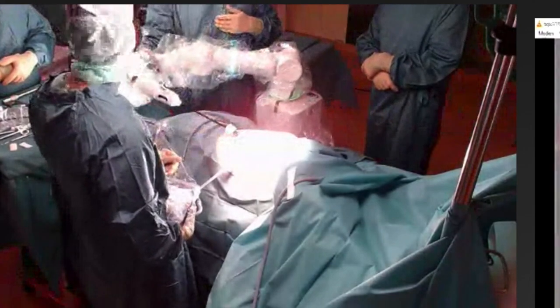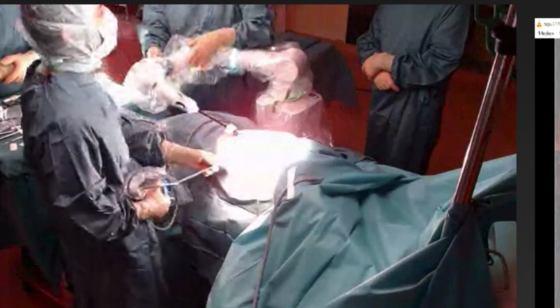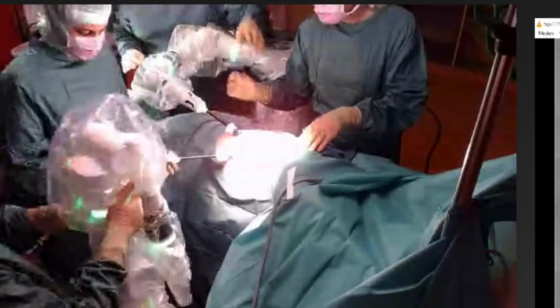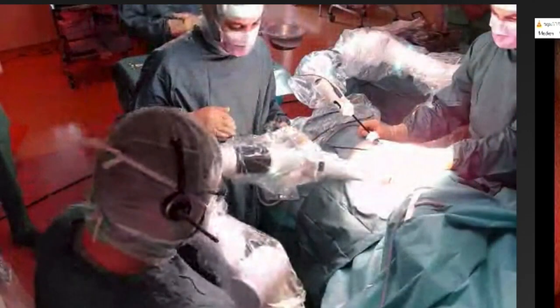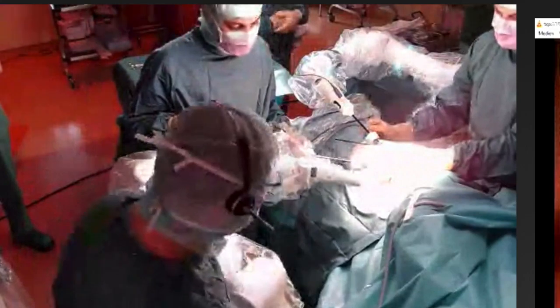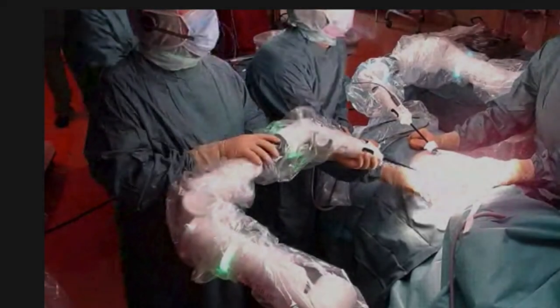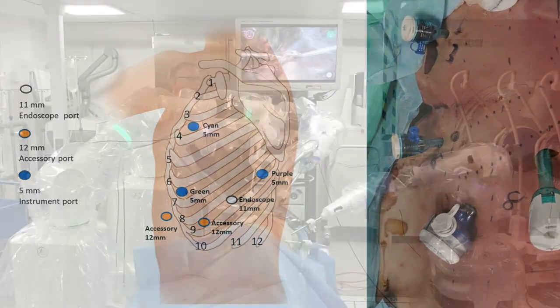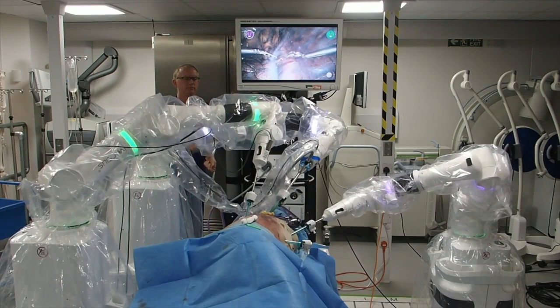Today we're going to do something extremely novel. They're already doing lobectomies, segmentectomies, thymectomies and today it's an absolutely brand new type of case - a laser metastasectomy. We're just going to show you how they dock the arms. This is a second instrument arm coming in and as you can see you just position it exactly where you want. It's very versatile, very manoeuvrable and then you dock each one in. We're going to be doing a left-sided laser metastasectomy. As a quick reminder this is the setup of the ports. We're actually not going to have a third port today, and this is what the arms look like in a lab, just for your information in case you haven't seen it before.